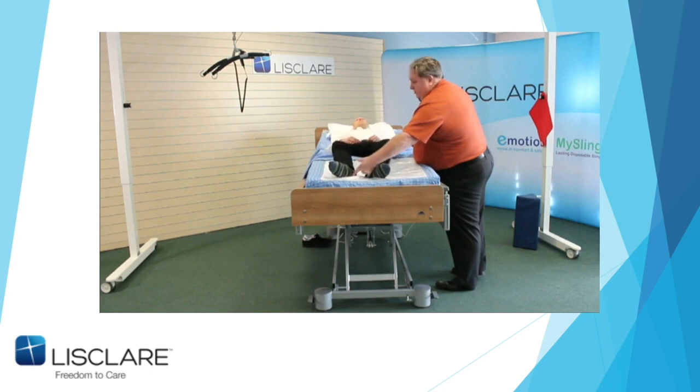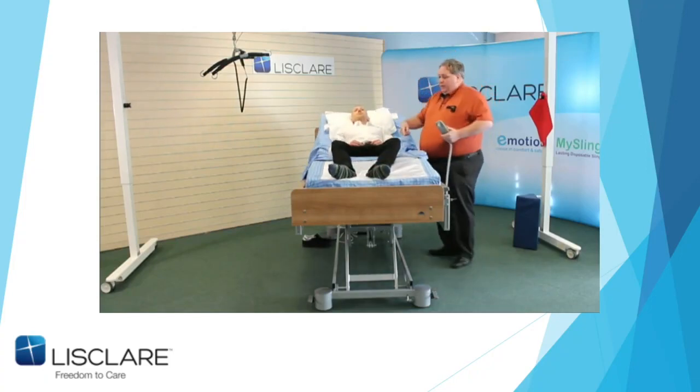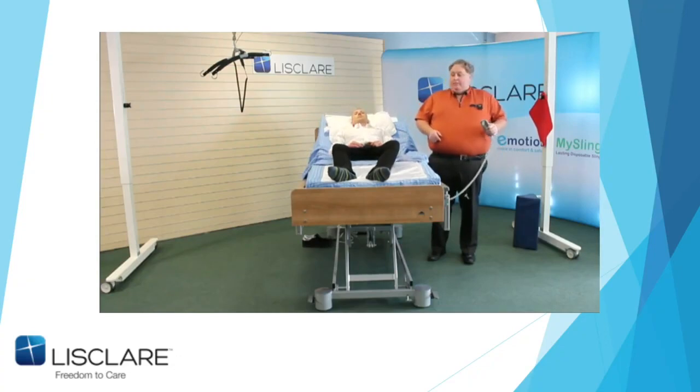slide up the bed. Now you can see why I was so adamant about having a low footboard, because you can see John's feet now do not touch the end of the bed. So at no point have I compressed John into the bed that way, or he's never felt the need to lift his hips and slide down the bed. So that when I bring him back down again, I'll just go completely flat with the auto contour.